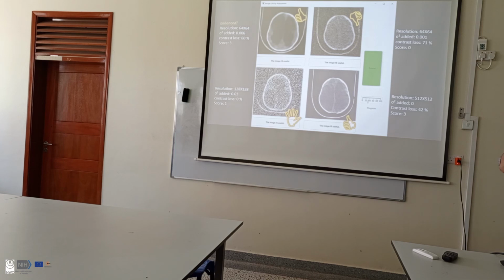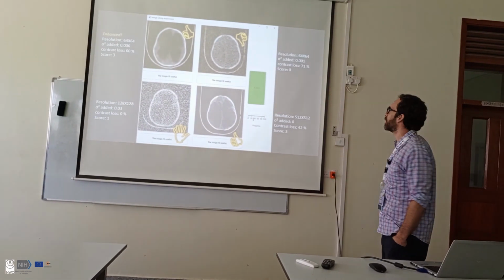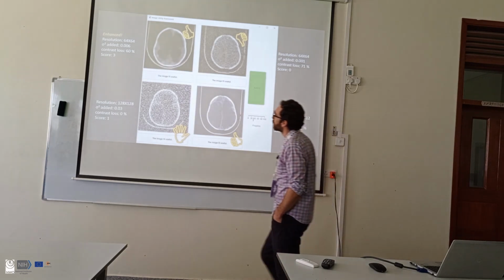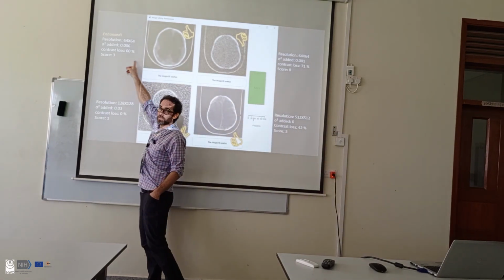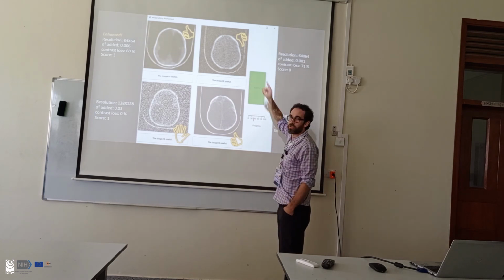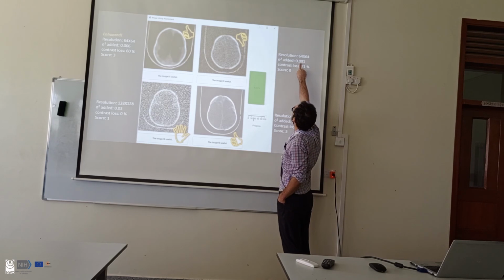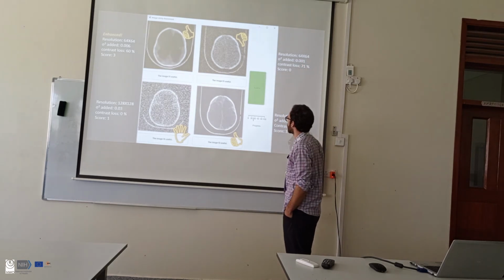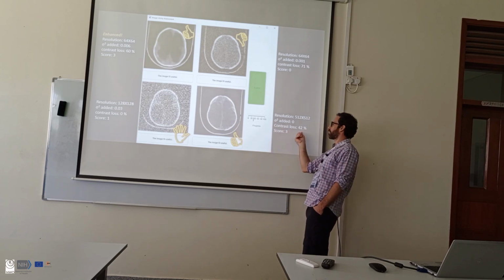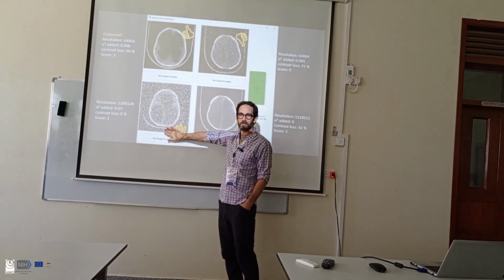They all liked the enhanced one. This is not feedback that I gave them; I put this in the section. They all liked the enhanced one, which originally had 60% contrast loss. None of them liked this image. It's very noisy, as you can see: 71% contrast loss, quite a bit of noise for a 64 by 64 image. They all liked this image, which had no added noise and 42% contrast loss. And only one of them liked this image.